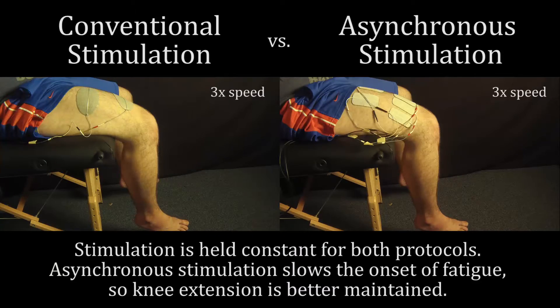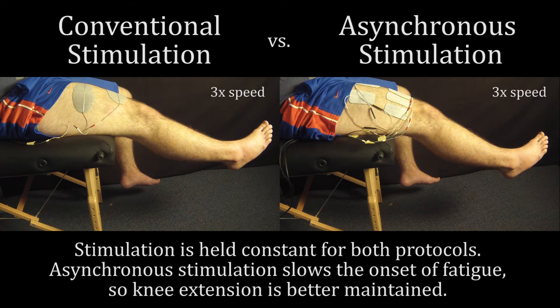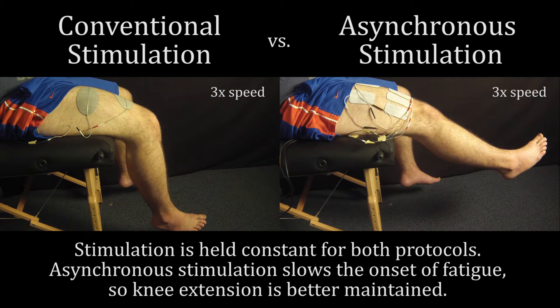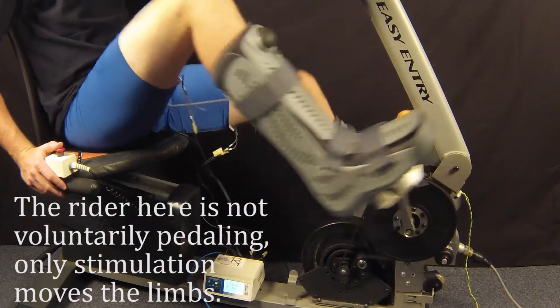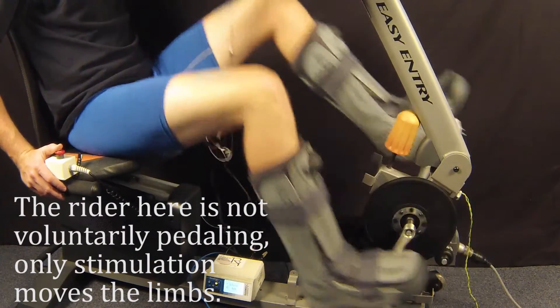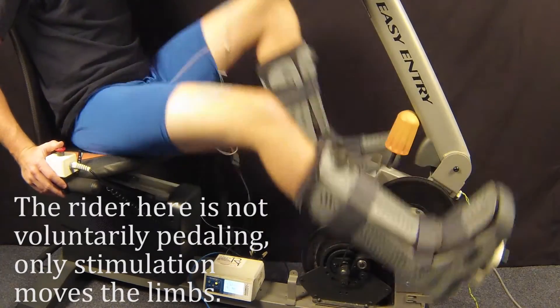The control challenge here is the use of switched systems control theory to stably switch between different actuators, each with different dynamics that are attached to the same joint. Multiple muscle groups are required for functional, coordinated limb motions. For example, cycling is an often used low-impact rehabilitative treatment, and switched systems theory can be used to switch between different muscle groups to enable a cycling motion.